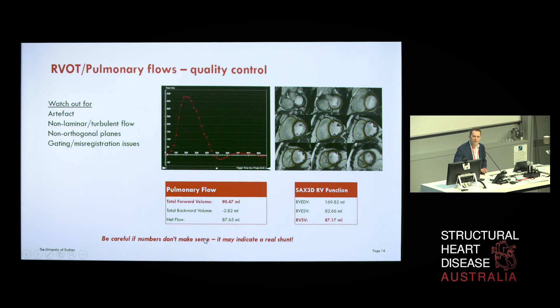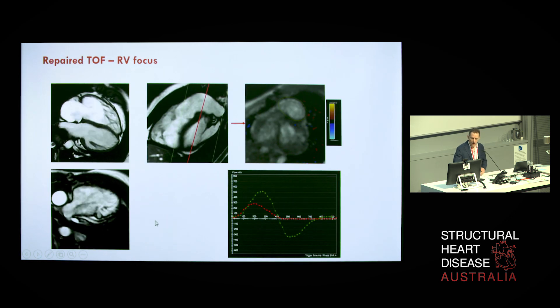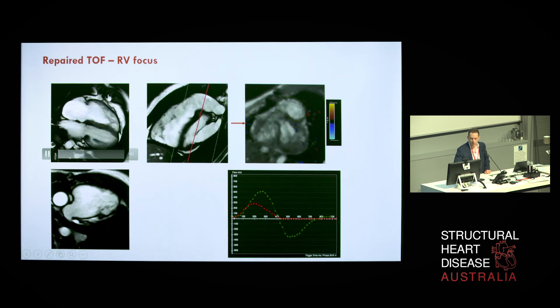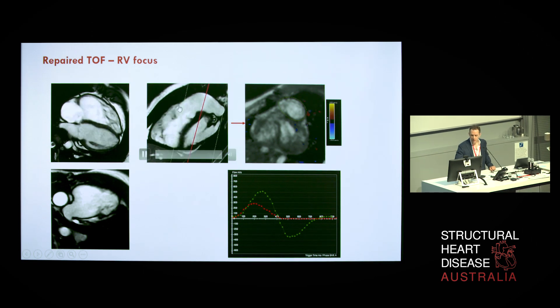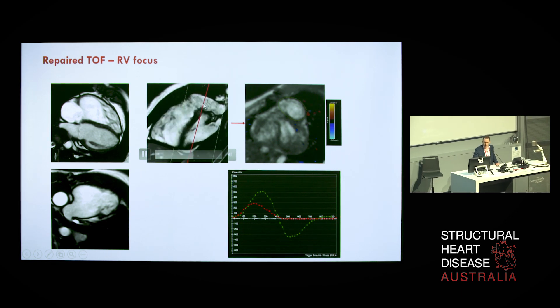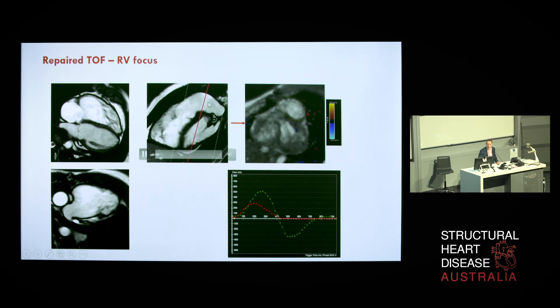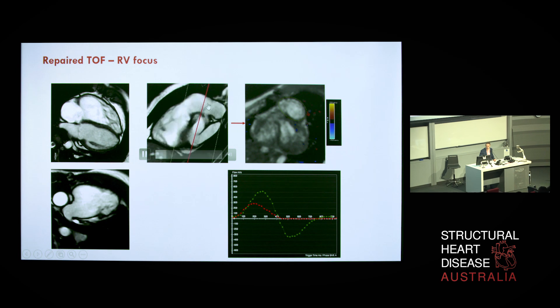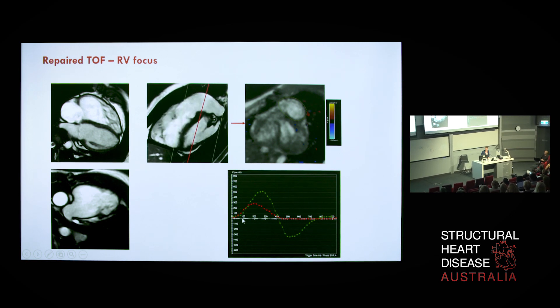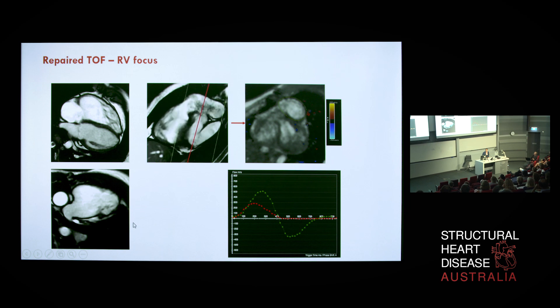The forward volume serves as an internal check that it equals roughly the stroke volume generated from contours. If there's a large discordance between the two values, one must ask why — is there a shunt, an error in data acquisition, non-orthogonal imaging planes, or a gating/misregistration issue from frequent ectopy or atrial fibrillation? Visually, you can see the right ventricle is enlarged relative to the left, the RVOT is hyperkinetic and dilated, and there's pulmonary regurgitation — though I'd caution against quantifying that visually on MRI as we're looking at dephasing rather than absolute flow.